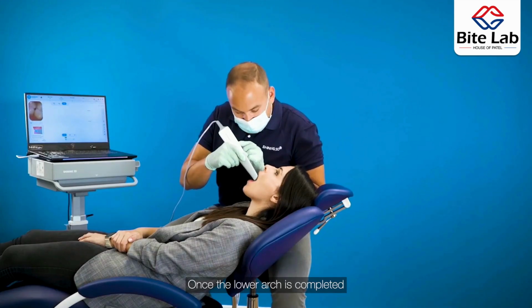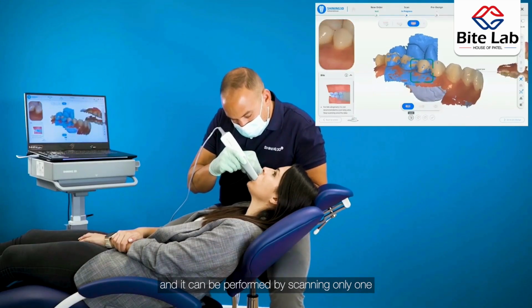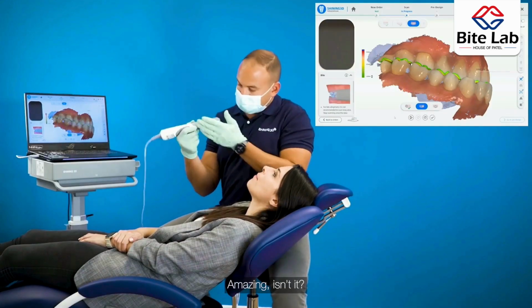Once the lower arch is completed, the alignment between the two arches is going to be incredibly fast, and it can be performed by scanning only 1, 2, or 3 sections of the arches in occlusion. Amazing, isn't it?